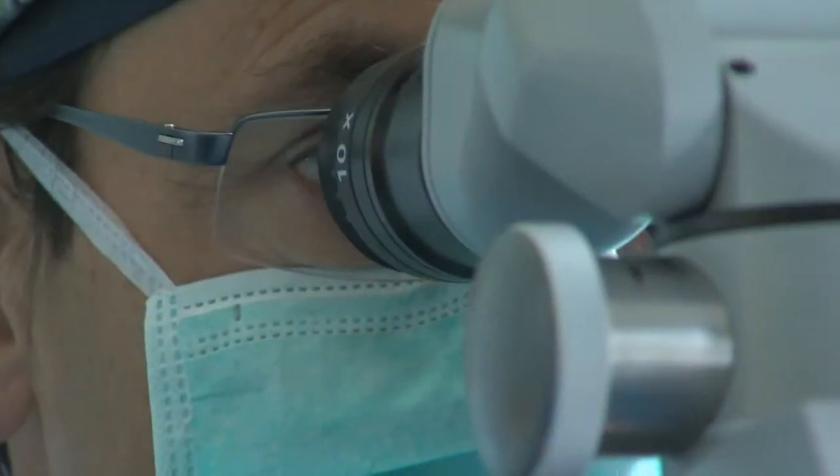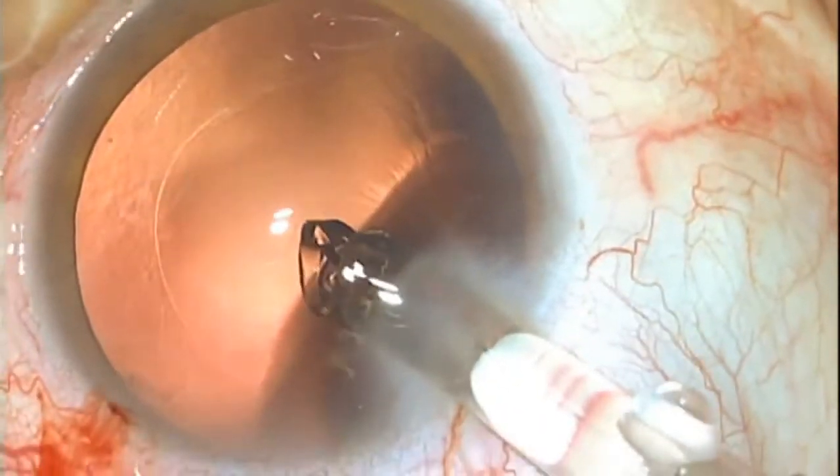Another characteristic of this lens is that it can be very well positioned within the capsular bag. With its side struts unfolded, it takes up all the space within the capsular bag with a very high contact angle. And even in cases where the pupil is very narrow, the lens positioning within the capsular bag is perfect.